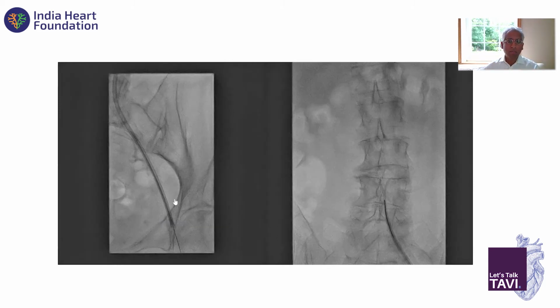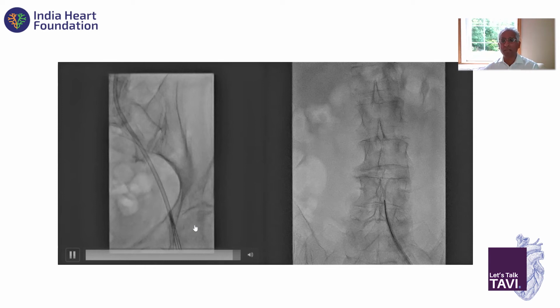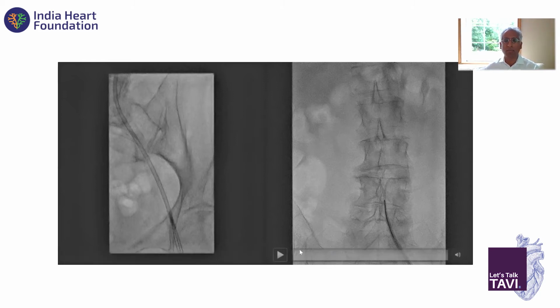So I am a ProStar person. I like the ProStar device. It, of course, is technically a bit more challenging, but it never fails in heavily calcified anatomies. You need to know the steps. And if you know the steps, in the last 1 year, 110 cases where I first operated, I had one patient who needed surgical correction. And it's not that I'm good. It's because there are steps. You follow the steps, and then you get good results with it.